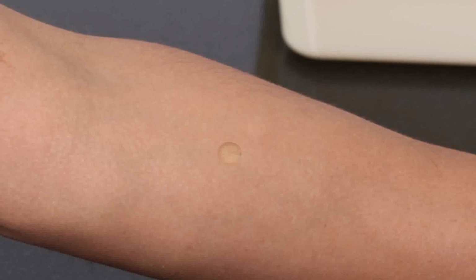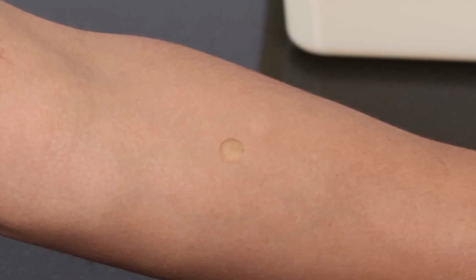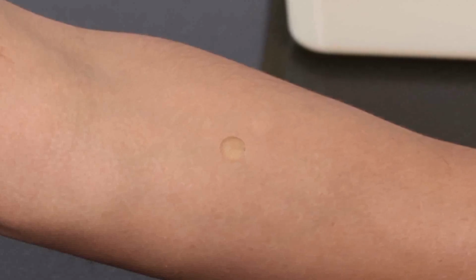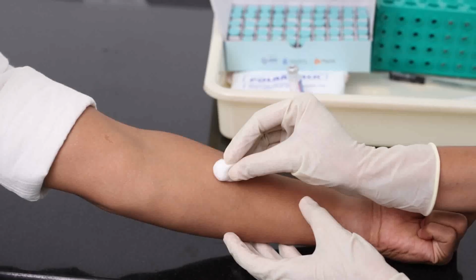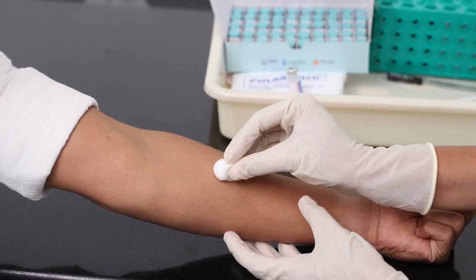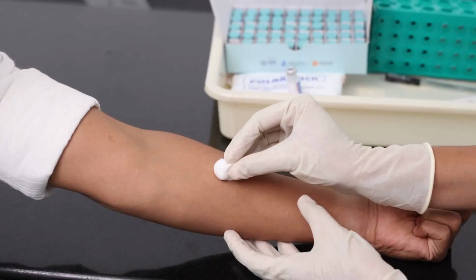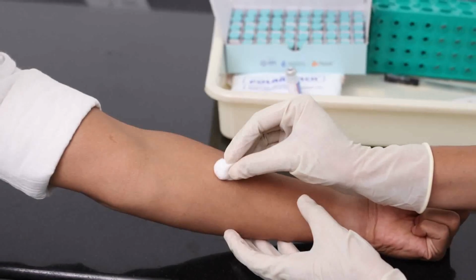If the papule is not formed, repeat the injection at least 2 inches away from the first site on the same arm or on the other forearm. If minor bleeding occurs, dab the injection site with a cotton swab or sterile gauze without applying pressure on injection site. Avoid covering the area with a bandage.